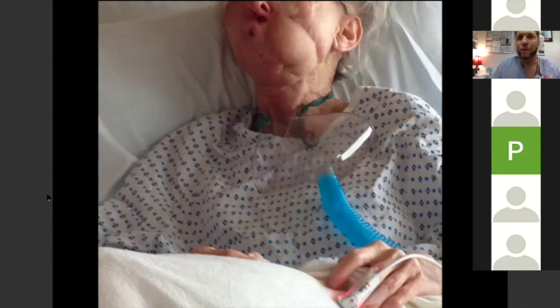You want to be real careful with any technique you do in someone status post radiation, because once you have bleeding, let's picture I go through her nose, right? So I sedate her, some remifentanil, topicalize her, I go through her nose and I cause bleeding. Where am I going to be? Now I have an airway full of blood with no mouth opening and I can't see with my fiber optic scope. So this particular patient, we chose awake tracheostomy. And the reason is I didn't want to cause bleeding by going through the nose.